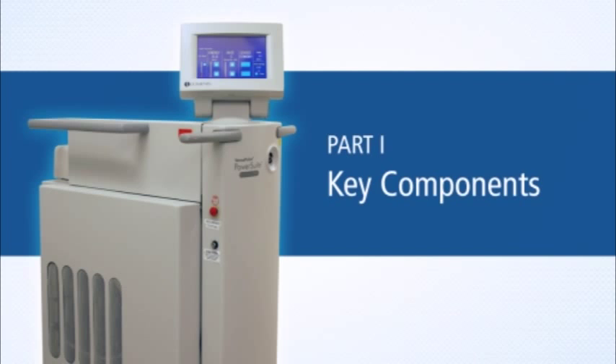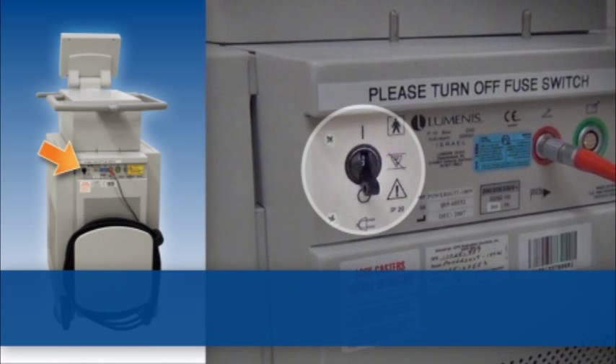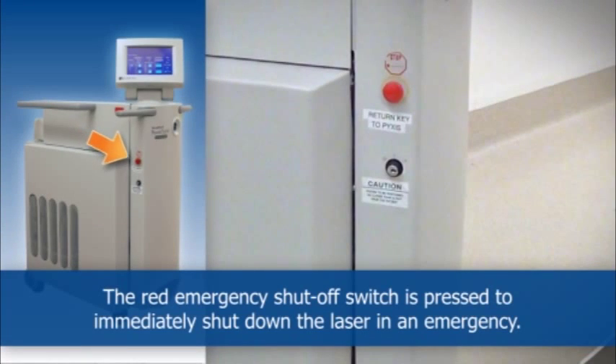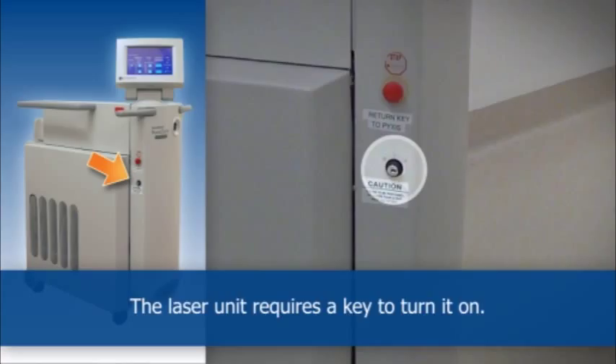Key Components of a Holmium Laser. The main power circuit breaker is placed in the on position at the beginning of setup, and in the off position after the last use of the day. The red emergency shut-off switch is pressed to immediately shut down the laser in an emergency. The laser unit requires a key to turn it on.